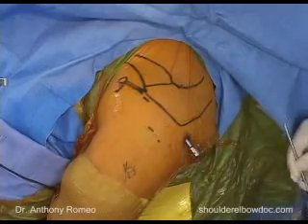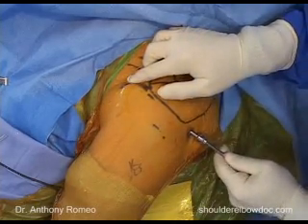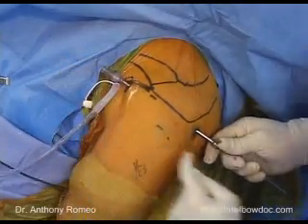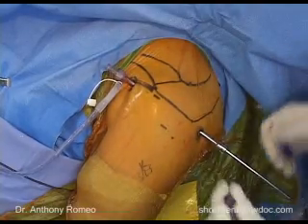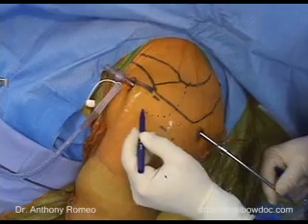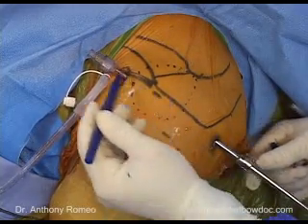Once in the subacromial space, I take our Wissinger rod, pass it through our cannula, drop below the coracoacromial ligament, and come out of our anterior portal. This establishes outflow right away, which helps with visualization. The subacromial space is a more anterior structure — if you bisect the acromion, it comes down off the edge in this area. We want our posterior cannula a little more forward and our anterior portal backed out slightly to make sure we're in the right spot.